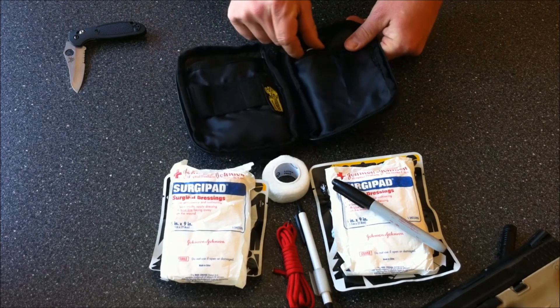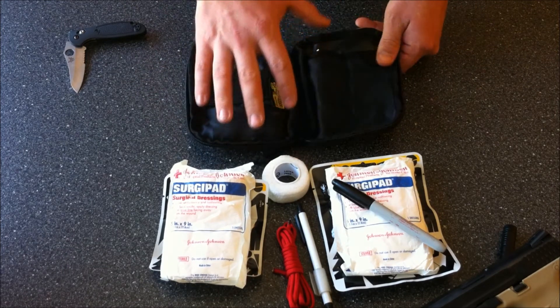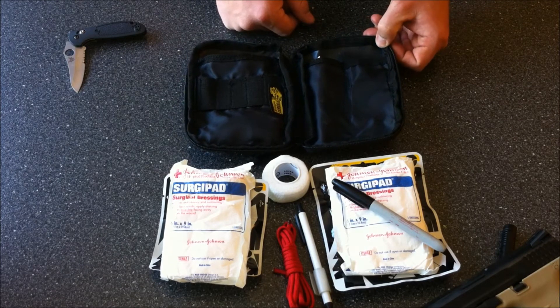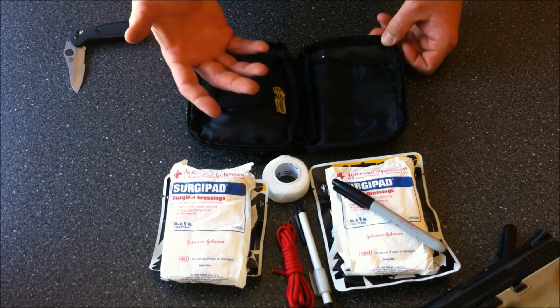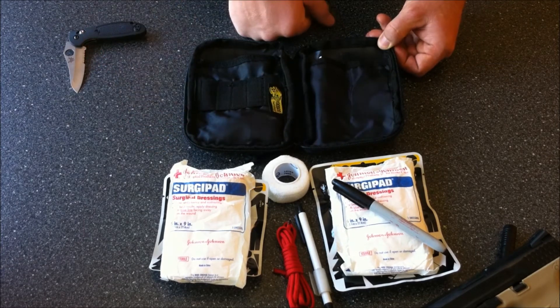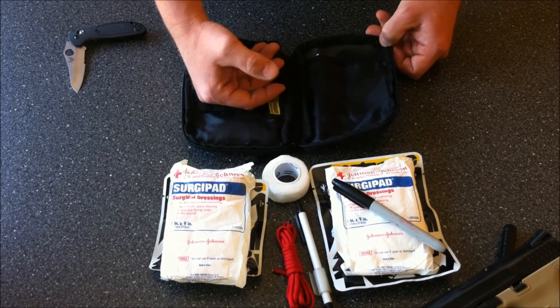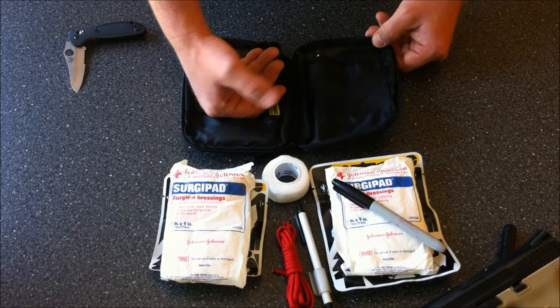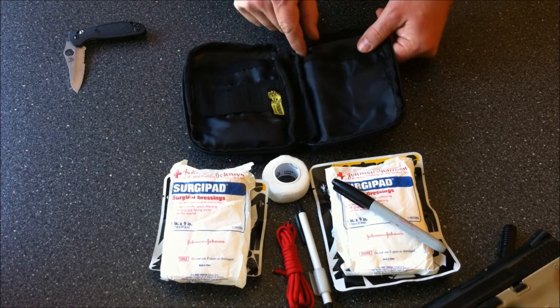That's pretty much what's in the bag, and it does a lot to slow or stop bleeding, especially in the extremities. You're also going to be treating the patient for shock, because blood loss leads to shock. If you don't know how to treat somebody for shock, go take a first aid, CPR, and AED course — through American Heart or Red Cross. You can find them anywhere.